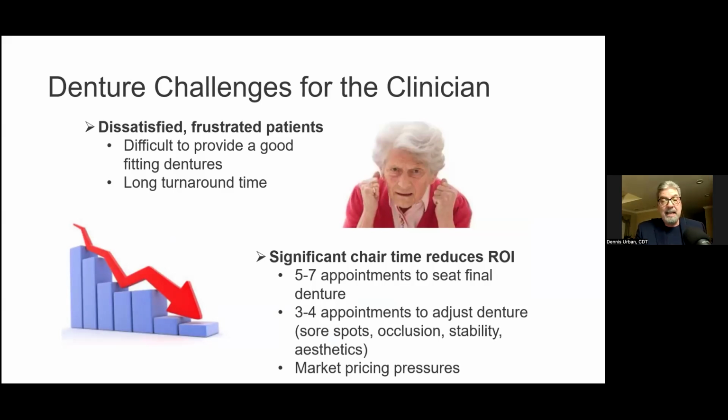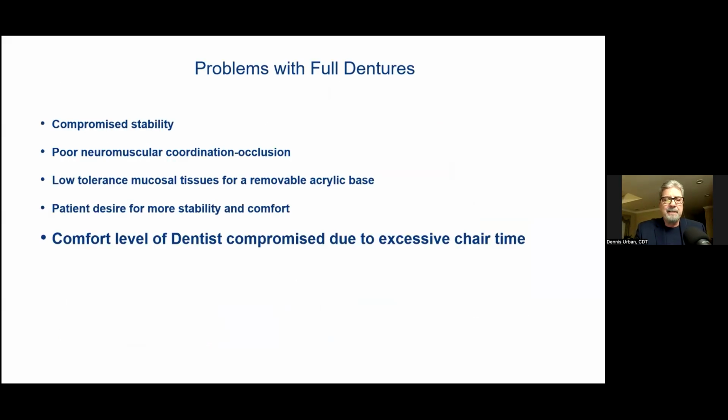I haven't had that many challenges over the years, because I know what to look for, how to plan a case, how to use the correct materials. I see those red flags on cases, and I stop the case, and we make things right. Whether it be an impression, or if I have concerns about occlusion, I communicate with the doctor for a successful case.